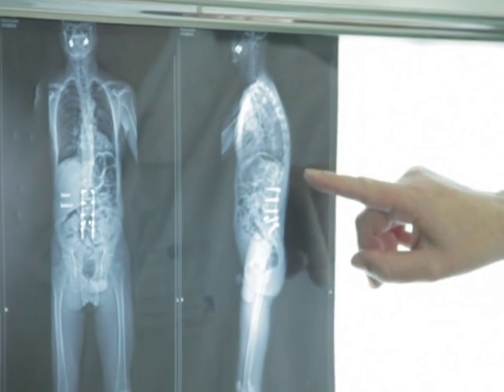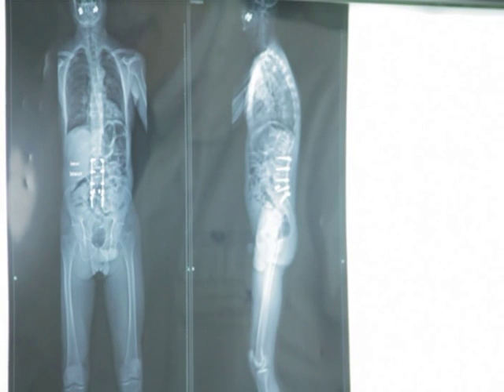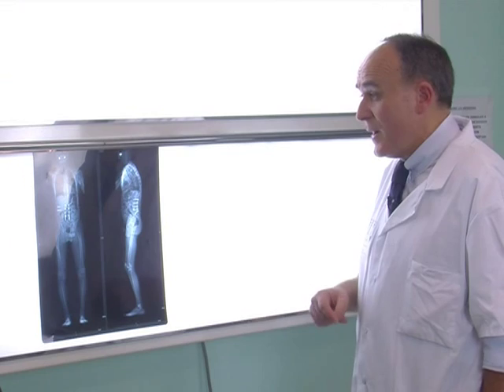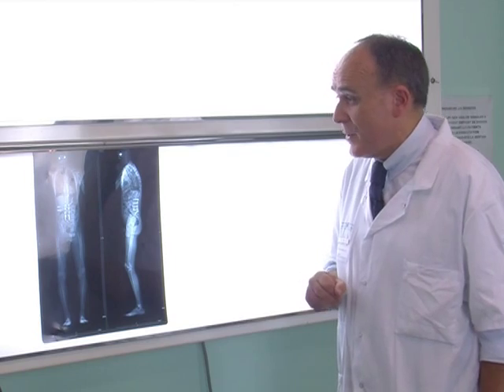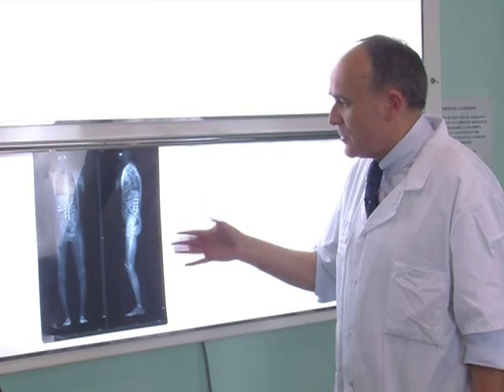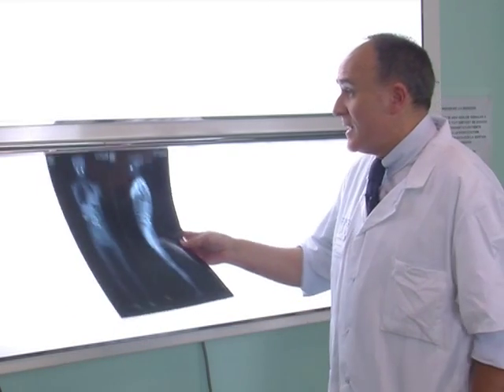As a hip, knee, and spine surgeon, sometimes we have to decide whether to begin with spine surgery or hip or knee surgeries first. This man was operated on — he had a previous posterior fusion — and you can see he has imbalance. Is it due to the spine, the hip flexor, or the knee flexor? With those images it is very easy to explain the global situation and the final result.